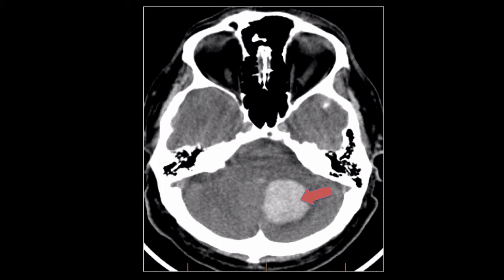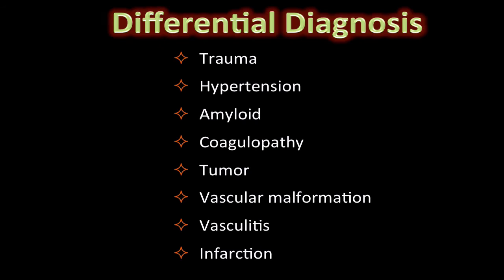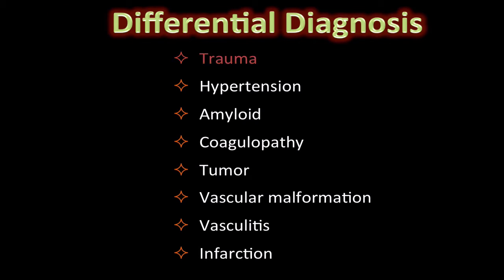This is consistent with hemorrhage. This is the differential diagnostic list for intraparenchymal brain hemorrhage — pause here and think about the provided possibilities. Trauma is a common cause of intraparenchymal hemorrhage; however, in the provided case there was no history of trauma and there were no secondary features to support this possibility. Hypertensive bleeds are very common.